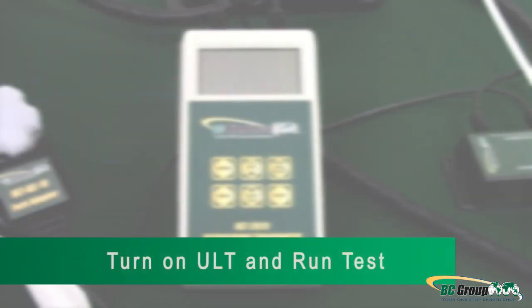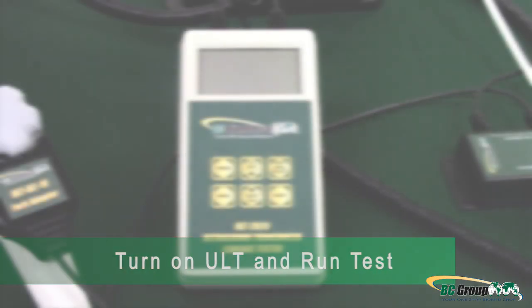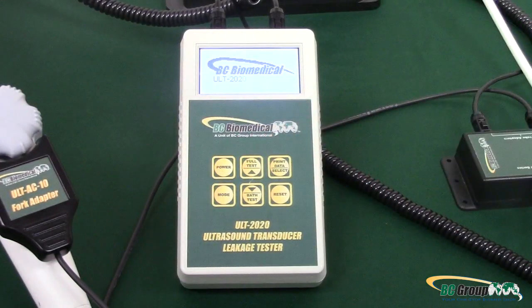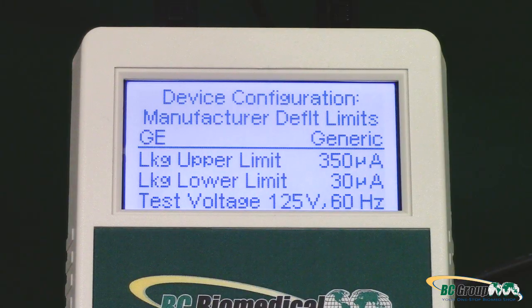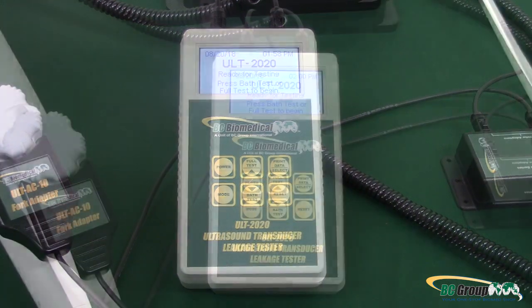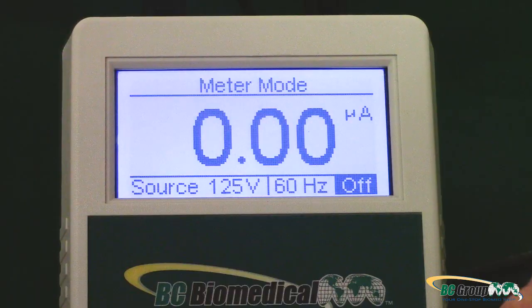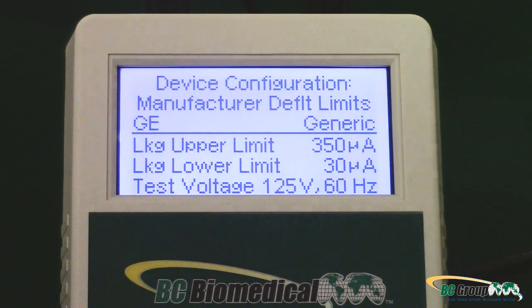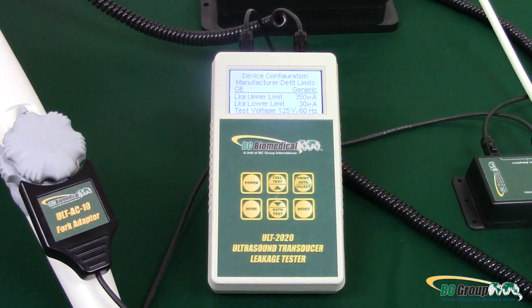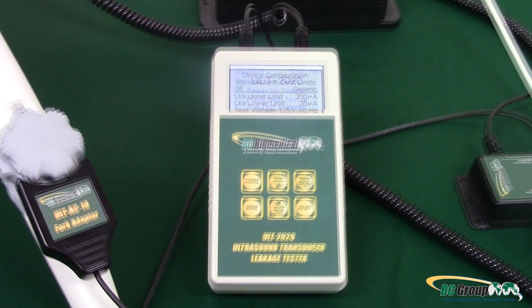Step 4: Turn on the ULT and run the test. Press the button marked Power on the ULT 2020. The screen should light up. If not, check to ensure the tester either has batteries or is powered by an AC adapter. Next, verify that the ultrasound leakage tester is set to a GE ultrasound probe on the device configuration screen. The device configuration screen appears briefly as the ultrasound leakage tester is powered on and can also be viewed by pressing the mode button three times.